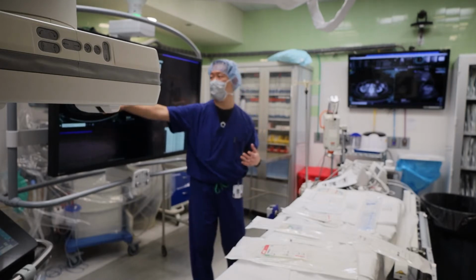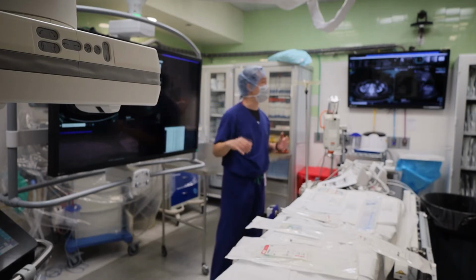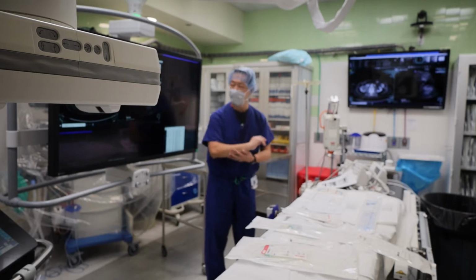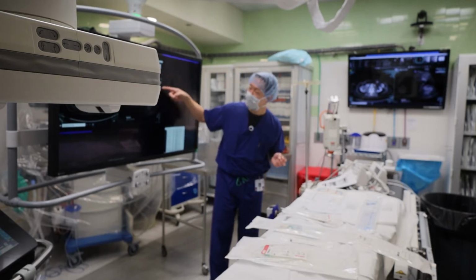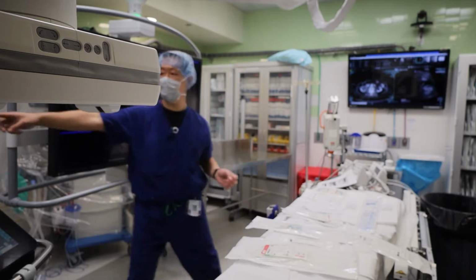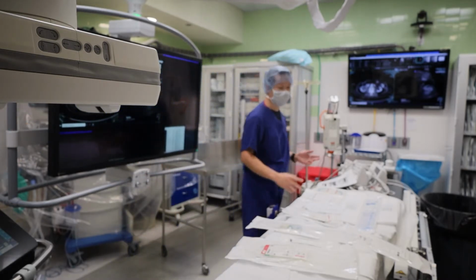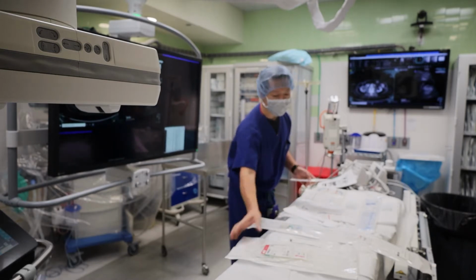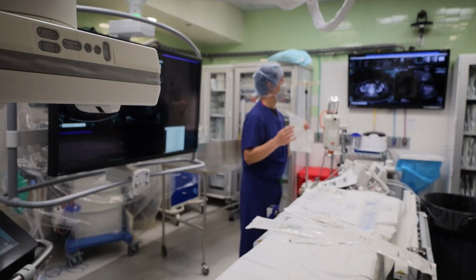So for example, this patient actually has a stent in there. This bright line is the stent, okay? So we cheat and look at stone configurations and stuff like that just to know where we're at. So when you access this, you can look at the ultrasound and see how deep it is. The markers aren't necessarily on this, and you can measure it. On this, obviously, you know how deep it is. And so that actually automatically limits what access needle you use. There's a reason why access needles are this long. It's so that you can access deep structures.